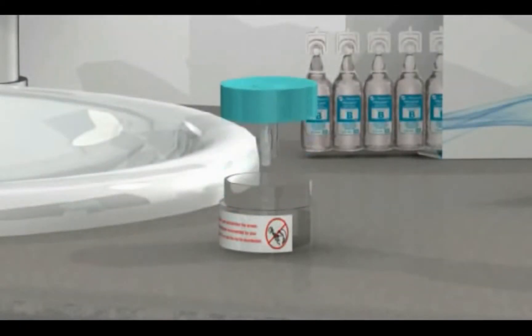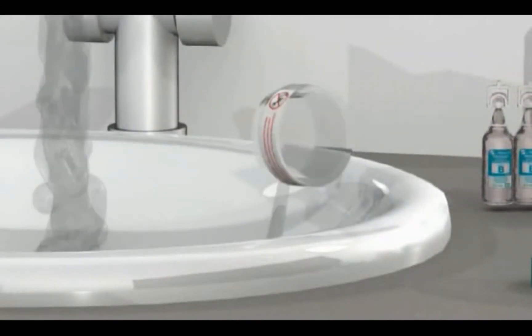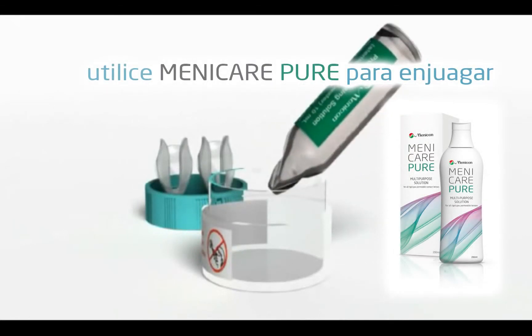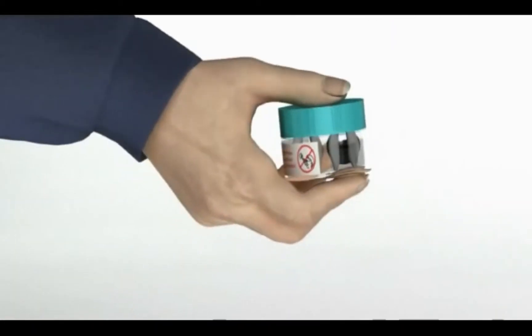Remove the ProGent vial cap and discard the mixture into a sink with running tap water. Open the ProGent rinsing solution. Empty the entire contents into the ProGent vial. Replace the ProGent vial cap tightly and gently shake the vial.